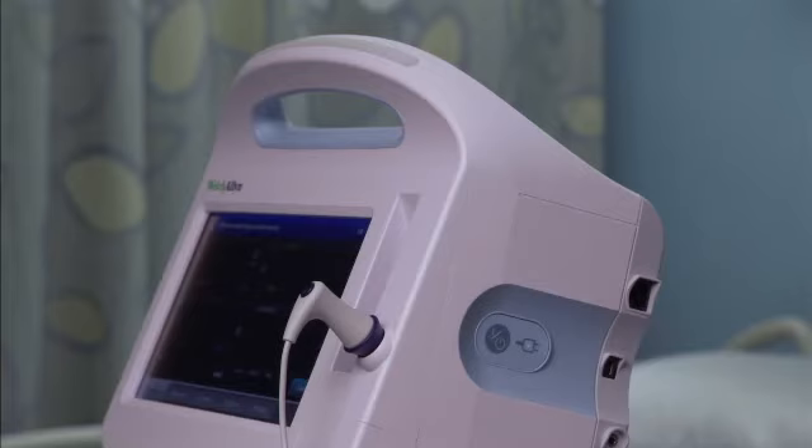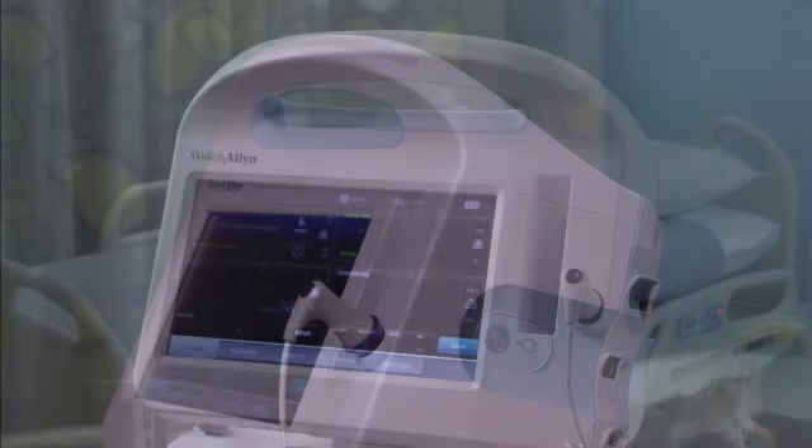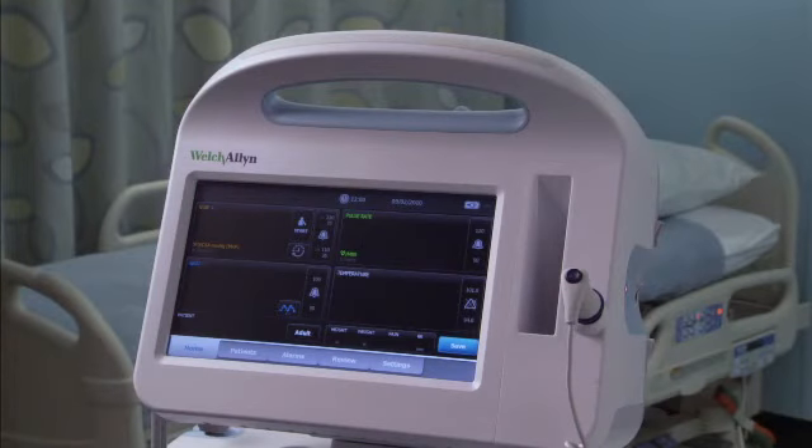Always use the monitor with an adequately charged and properly functioning battery. For continuous monitoring, always connect to AC power. The start-up screen then appears with the banner across the bottom. Your monitor is now ready to use.